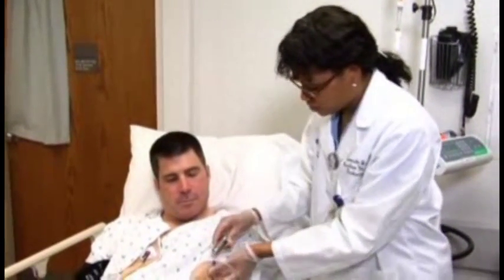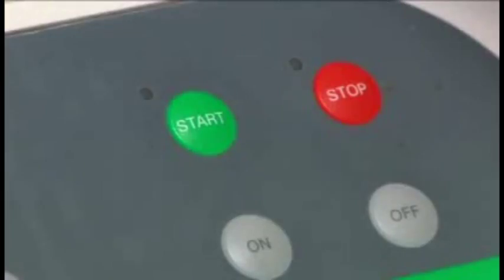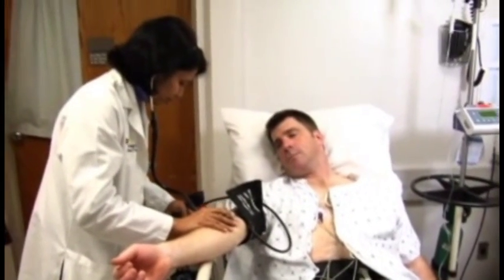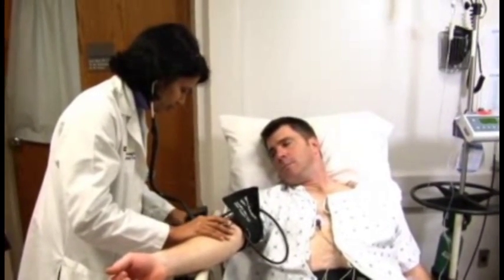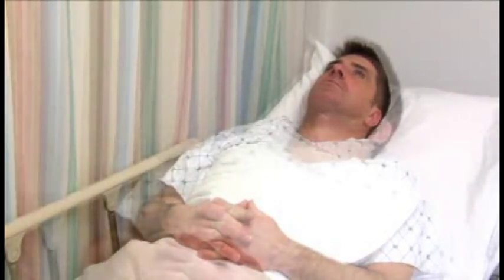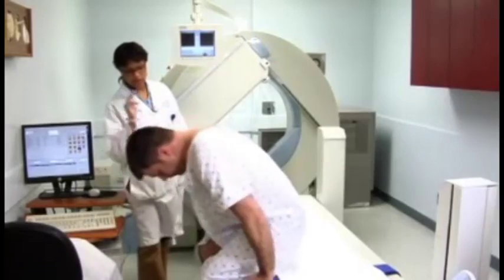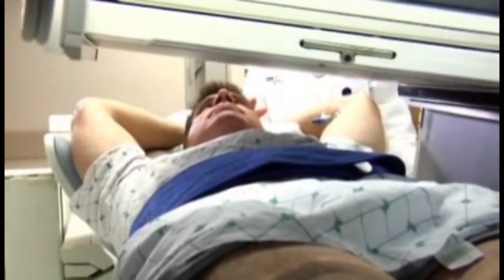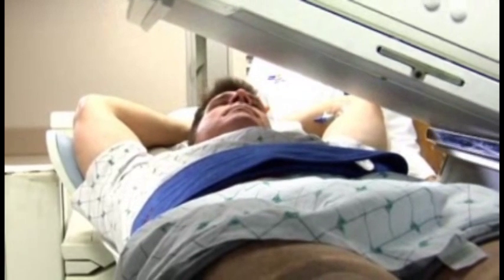Near the end of the infusion, you will receive another injection of a radioactive solution so that blood flow to your heart during stress can be assessed. After stopping the adenosine infusion, you will continue to be monitored until your heart rate and blood pressure return to pre-stress levels. After this, you will have another break. This break is required to allow time for some of the radioactive substance to wash out of your gallbladder and bowel. Finally, you will lie back down on the scanning table to be imaged by the gamma camera for another 20 minutes. This part of the test evaluates blood flow to your heart muscle at stress.